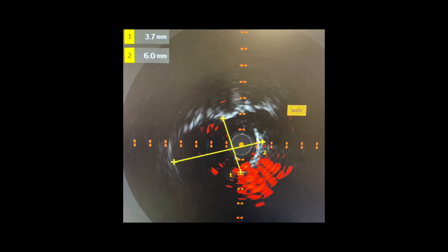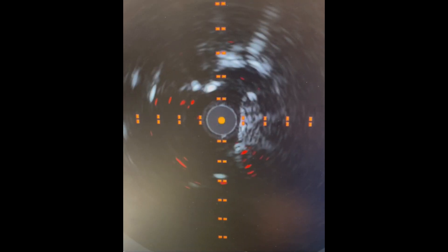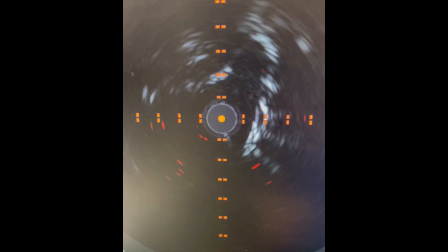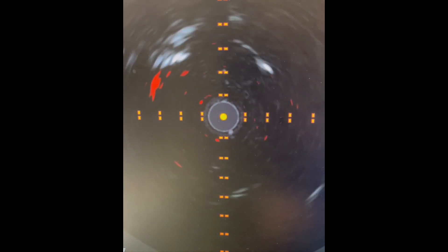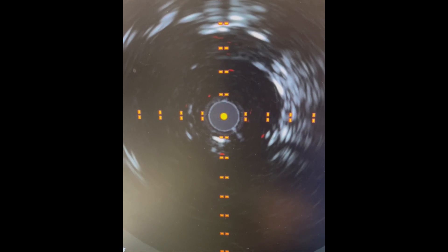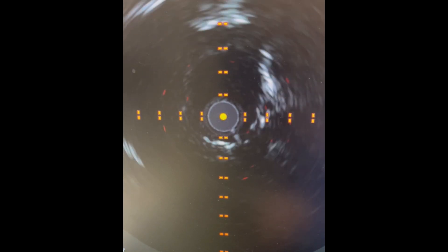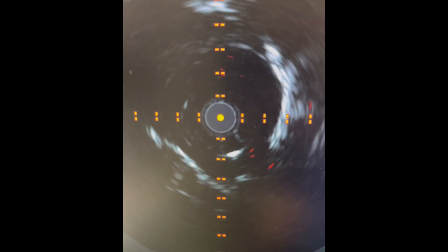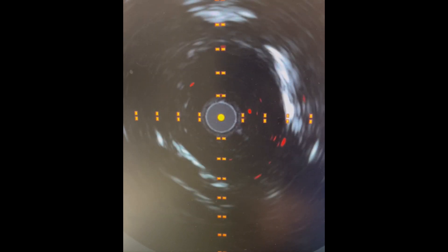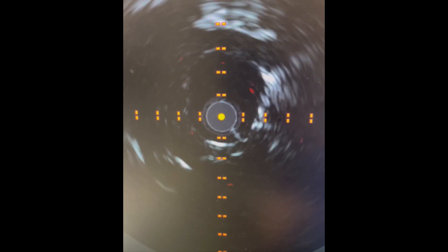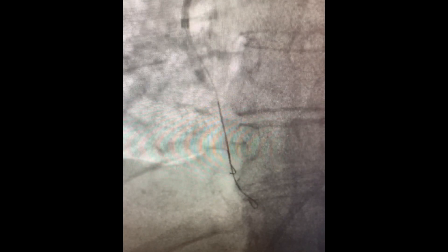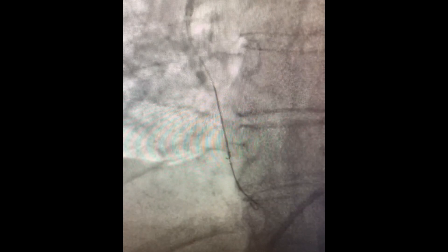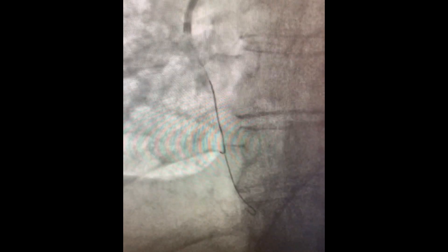The distal pressure is improving as soon as the wire crosses the big web causing the severe stenosis in that branch. We use IVUS for additional safety in order to size the balloon appropriately. Usually, 50% of the size of the vessel is what we target.